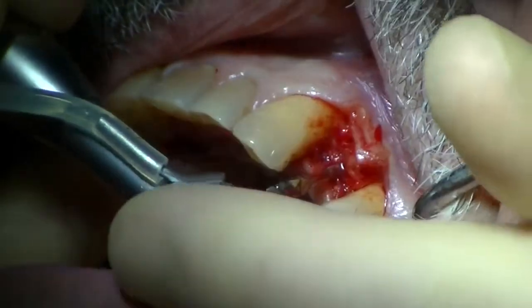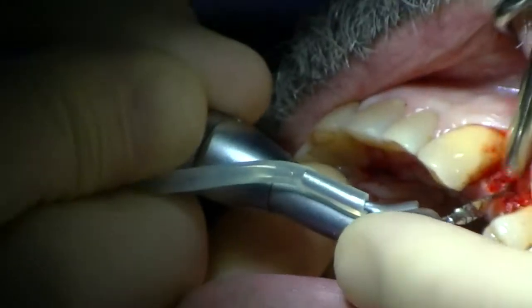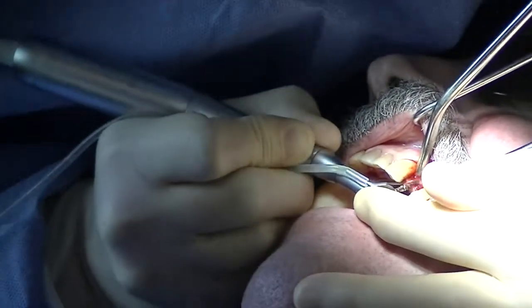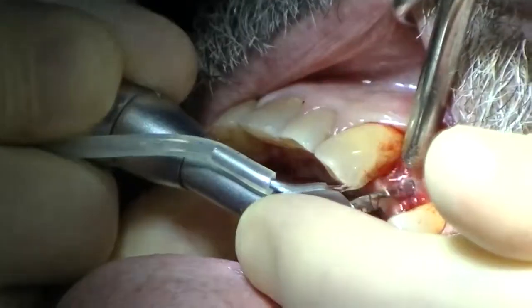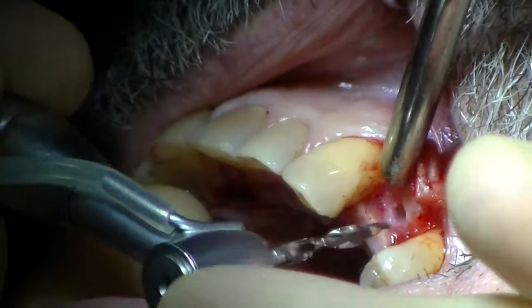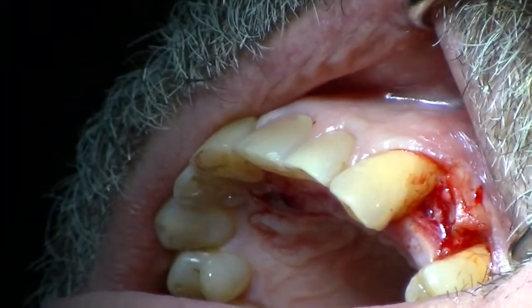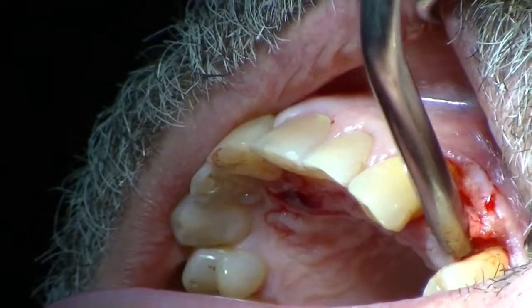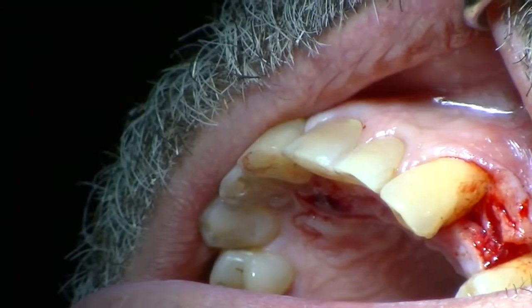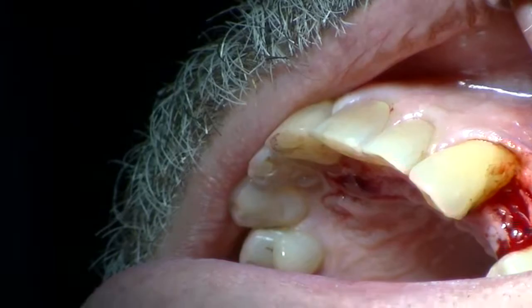And I'd like you to use two hands if possible. I know for video demonstration it's a little bit challenging, but, and I'm pumping. And I'm simply going about 4 millimeters. And at this juncture, we could take a radiograph and see our positioning. But again, to expedite, I think we understand the process.